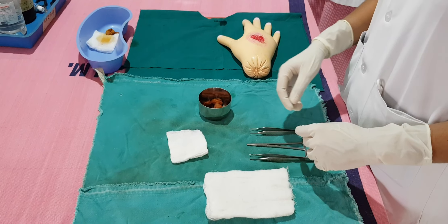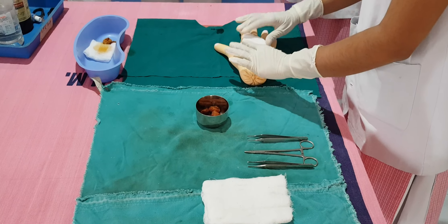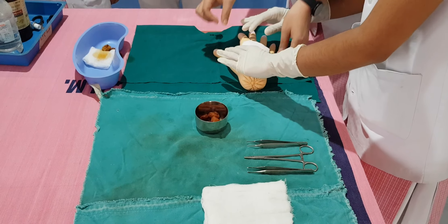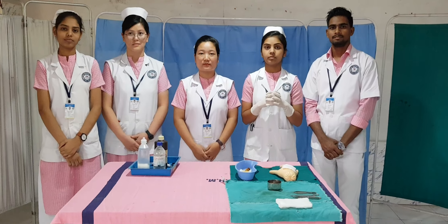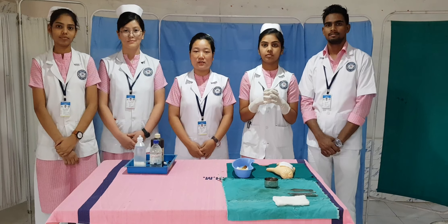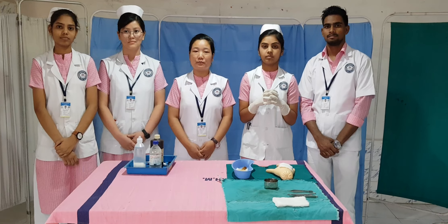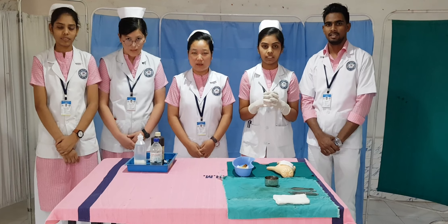Now we will apply antiseptic ointment, then put on the bandage. As we have completed our procedure, the major advantage of this simulation model is to improve our clinical skills. Thank you.